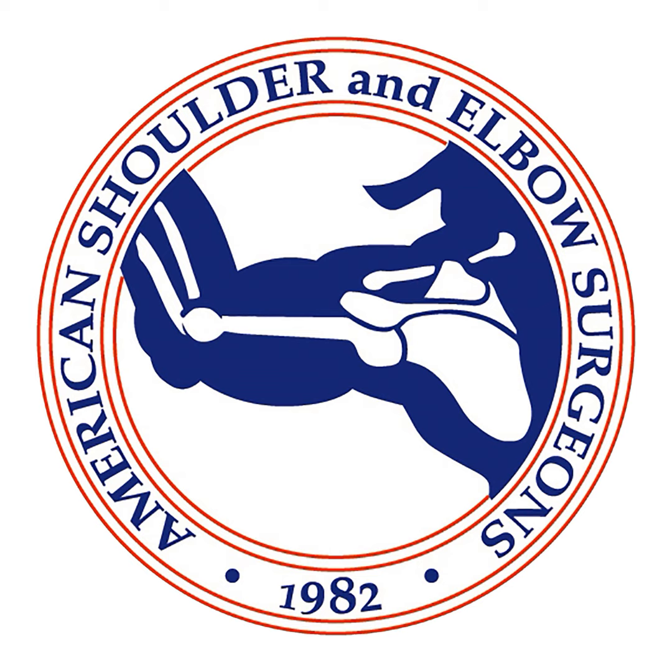And similar to the experience with the anatomic stemless implants, the results of a stemless reverse implant in terms of humeral complications are about the same. So there's no increased incidence of osteolysis or loosening or failure related to humeral fixation. So I think they're going to be fine. I've been very impressed with the modern stemless implants that we have. Every time I do one on an anatomic total shoulder, I think to myself, man, I can't wait to do these on reverses because the fixation is so good. I don't really have any reservations to start doing those.